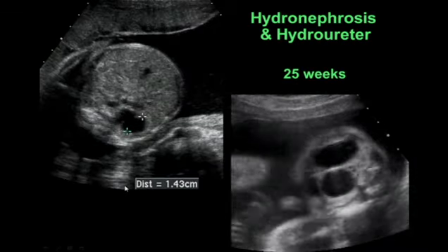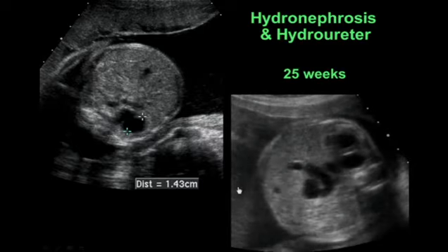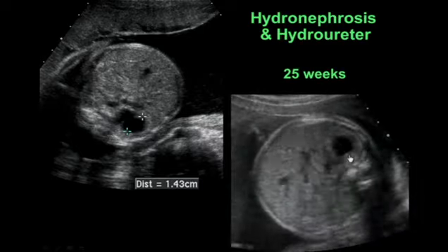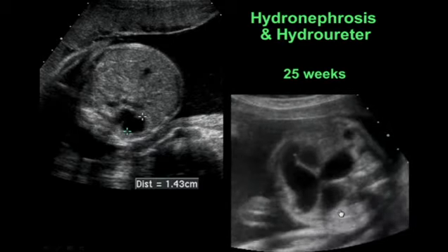Here's another case. This is at 25 weeks gestation. We see a dilated renal pelvis, and then scanning inferiorly through the fetal abdomen, we see a markedly dilated ureter as it extends down to the bladder.